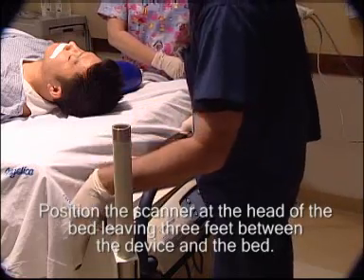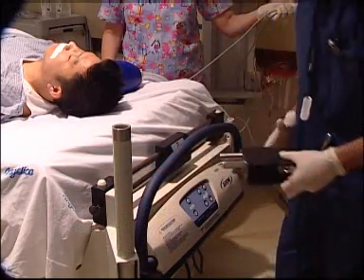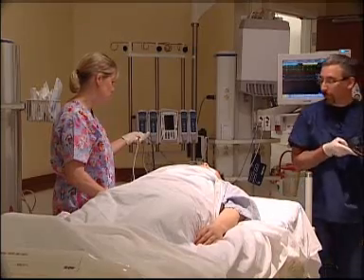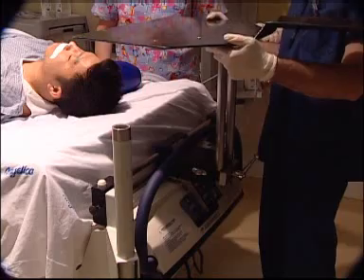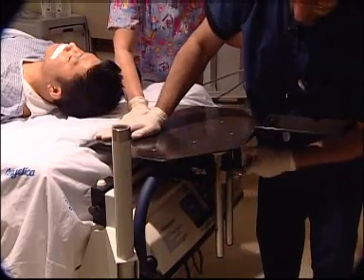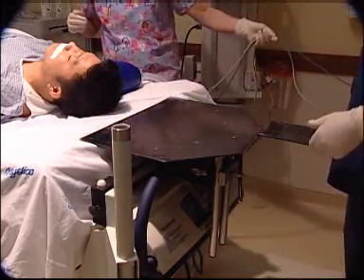Position the scanner at the head of the bed, leaving 3 feet between the device and the bed. This is important so the user has room to attach the scan board without hitting the front of the scanner. Mount the adapter on the headboard mounting pins. Secure the scan board to the adapter while simultaneously pressing down on the scan board onto the mattress and tighten the handle.